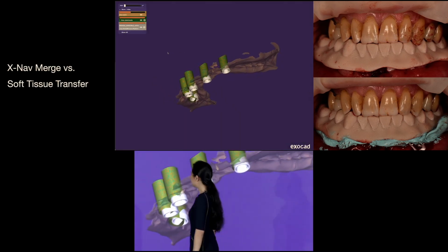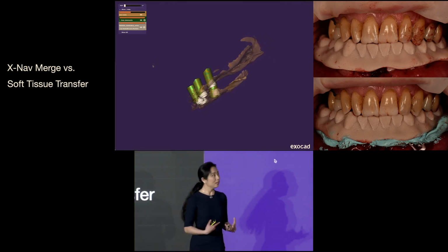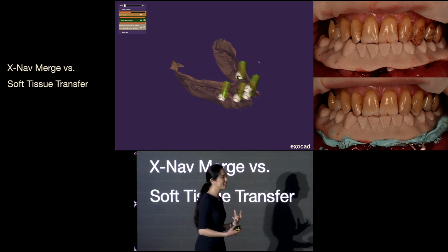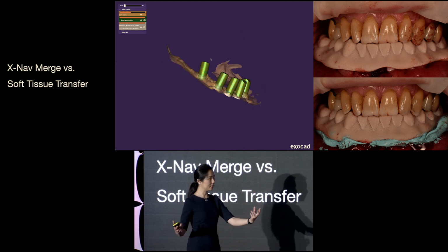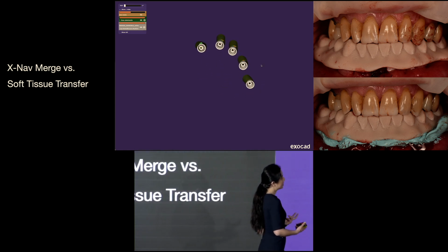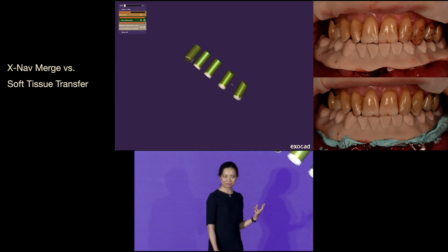And here I can actually show you what the difference in output was, because as we all saw, the CBCT had a ton of scatter in it, and try as we might to match the cleaned up scan data, or CBCT, to the diagnostic scan, we already knew there was going to be some degree of error. And so what you're seeing here is a deviation of probably about 1 millimeter.